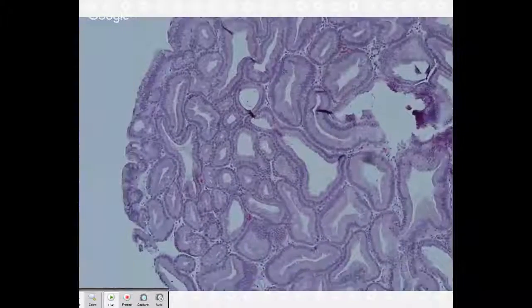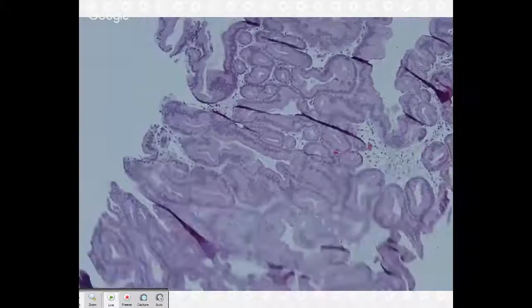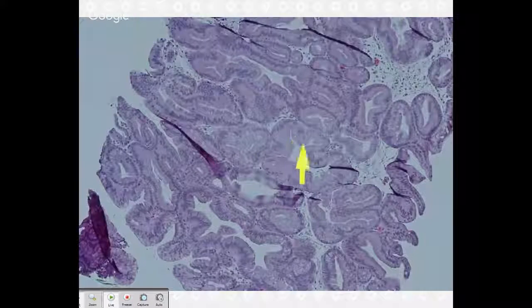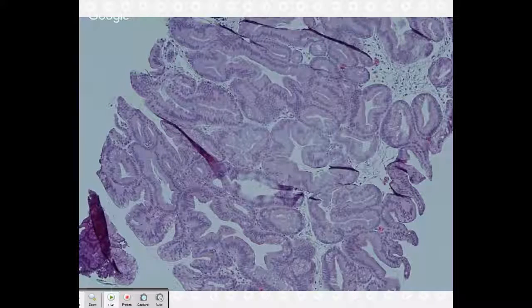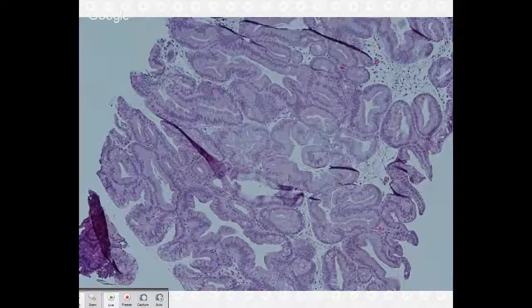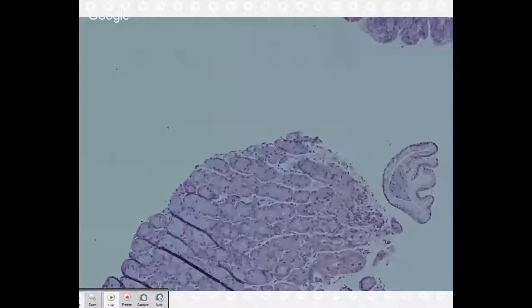I always wondered that for radiologists too. They always talk about ground glass opacities. I never knew what that meant, but I am perpetuating the term ground glass cytoplasm in this entity because I think it is descriptive of the tinctorial quality of the cytoplasm. It doesn't look like the cytoplasm you see in an adenoma, right?